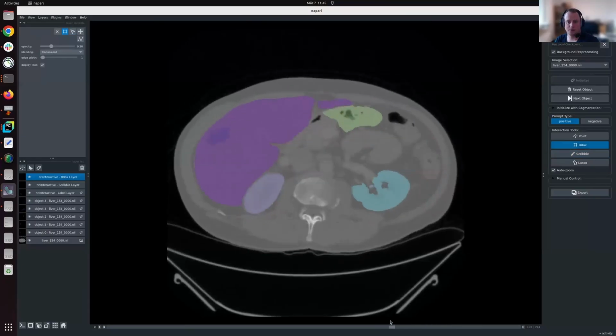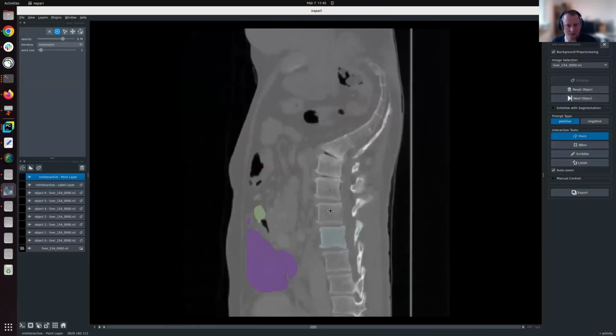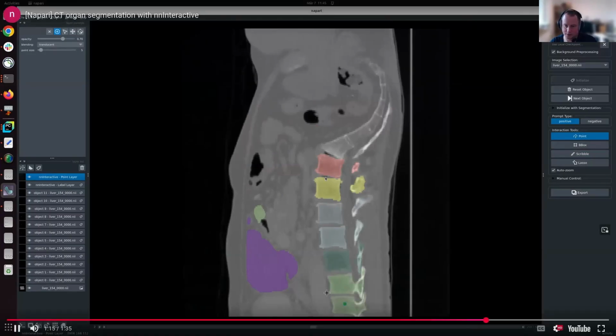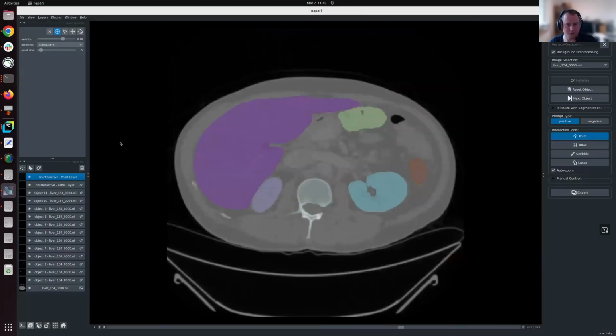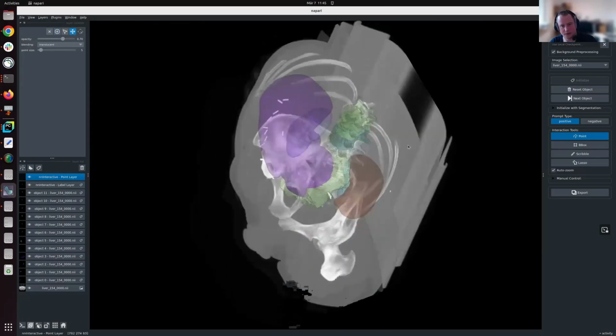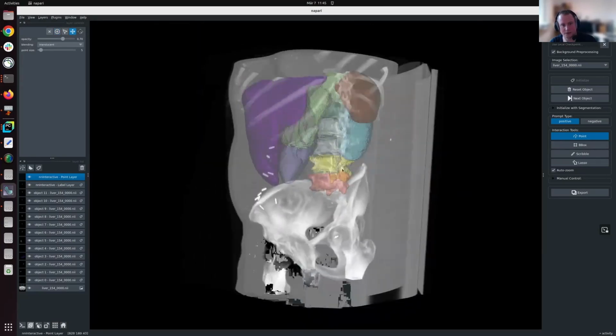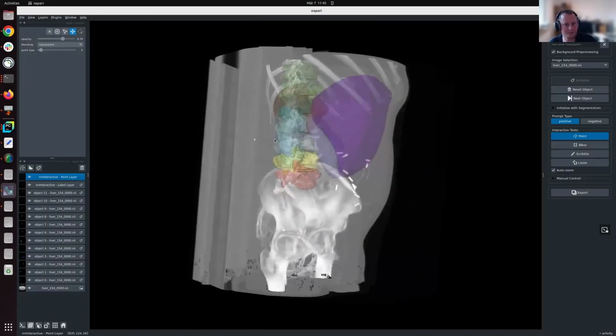And this really highlights that we also want to be able to resolve ambiguities. So what is it that the user wants? Do they want the liver? Do they want the tumor? We really want the tool, nnInteractive, to follow the user's guidelines here. Yeah. So let me play this out for a couple more seconds. In the end, we see a 3D rendering of the segmented objects, and this really shows you that we have now successfully created a bunch of 3D objects with very simple interactions in this image.